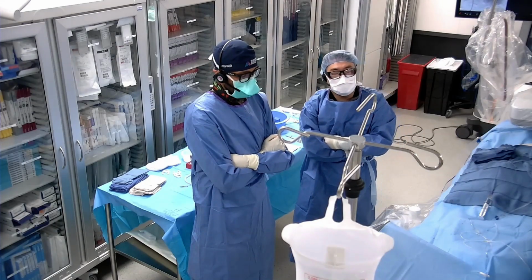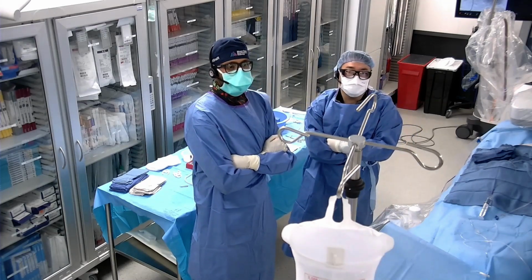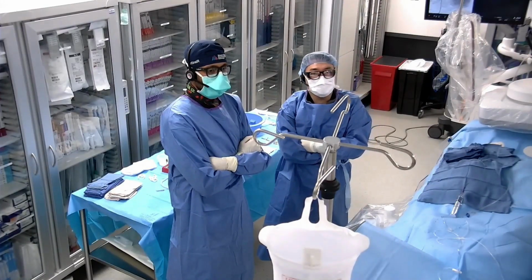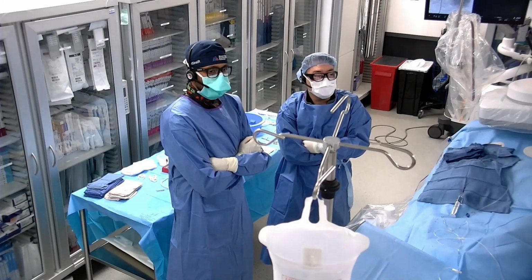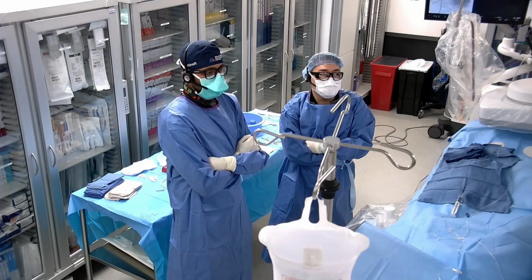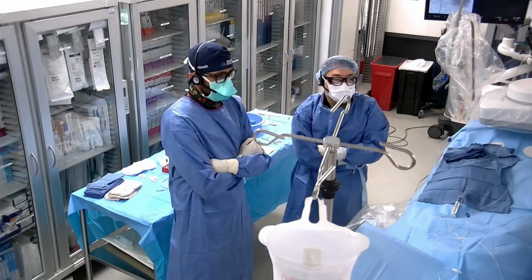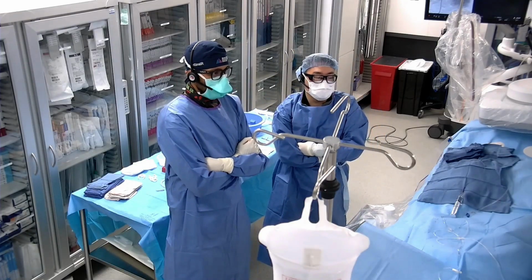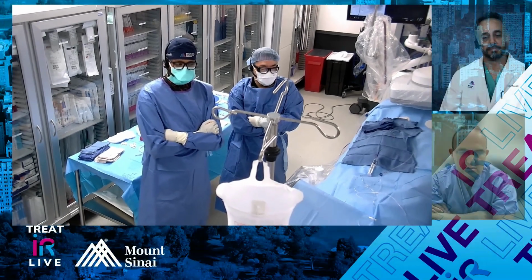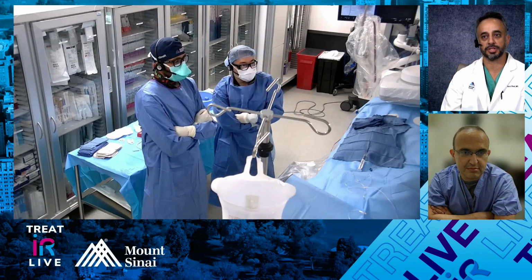But to be quite honest, when we spoke with her, we spoke with our referring hepatologist. She has splenomegaly, portal hypertension. It might not be such a bad thing to have a portion of this actually have its blood supply reduced. And so she wanted to go ahead and embolize this. Her proximal splenic artery is about 7.5 millimeters in size. And so this is well over 2.5 times the size of the vessel just proximal to it. And the other thing is, as you mentioned, it comes to us from our hepatologist. We obviously have a good relationship with them.